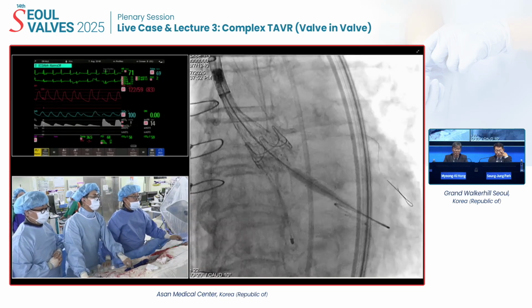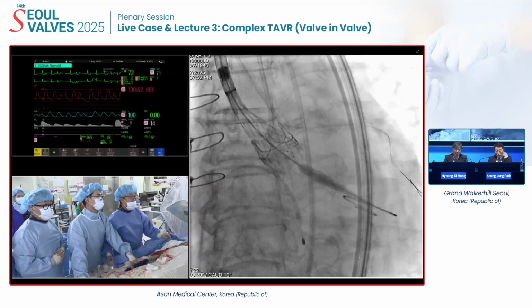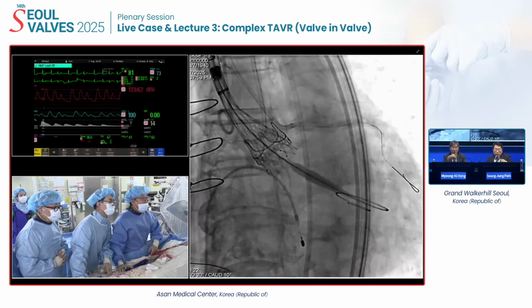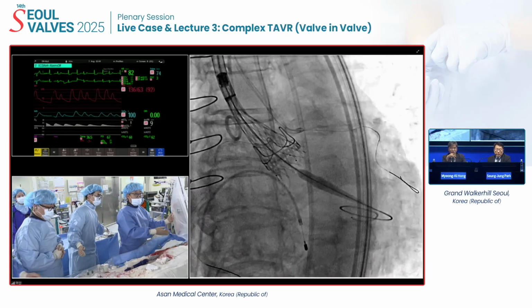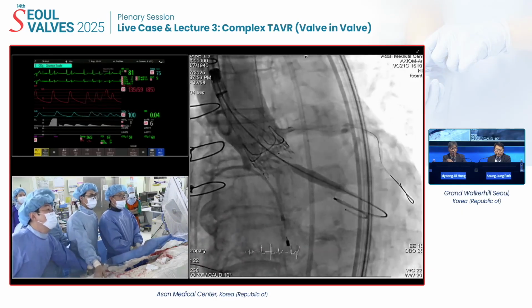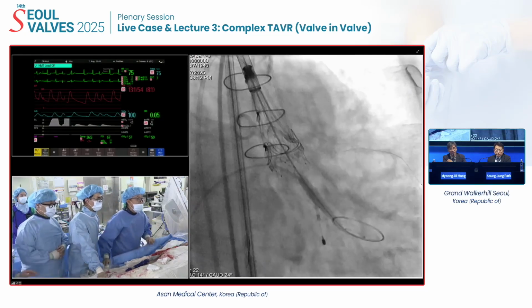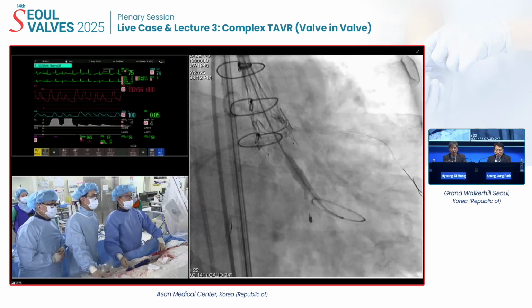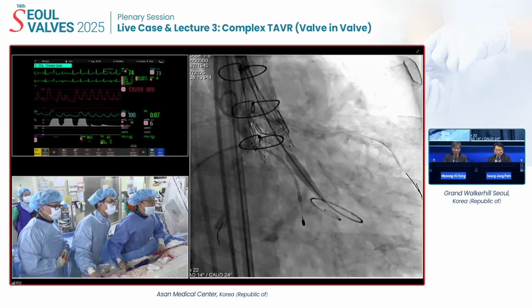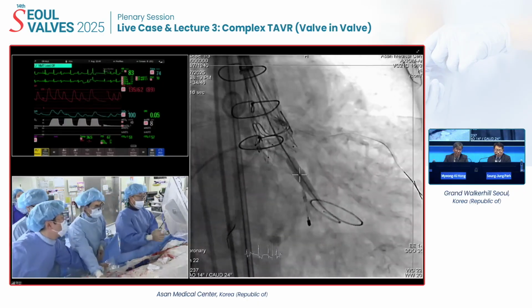Okay, let's take a shot here. Ready? Okay, it's good. I think it's perfect. Considering the very high risk of the patient, and this is the third trial, it is good for the release of the valve. This is the cusp overlap view. The result is not 100% perfect, but it is acceptable. Okay, now there is no AR. Let's check the coplanar view from before and release here.